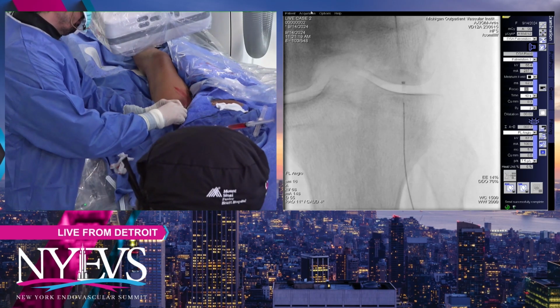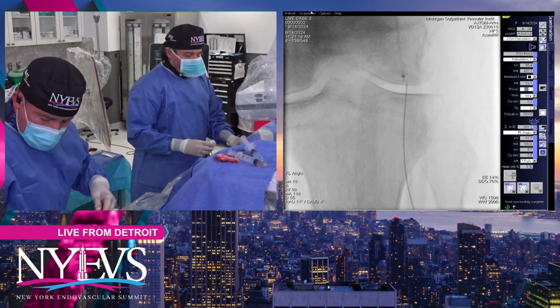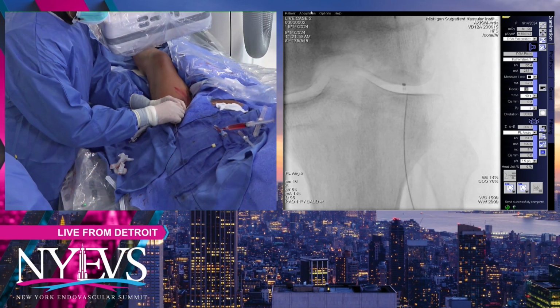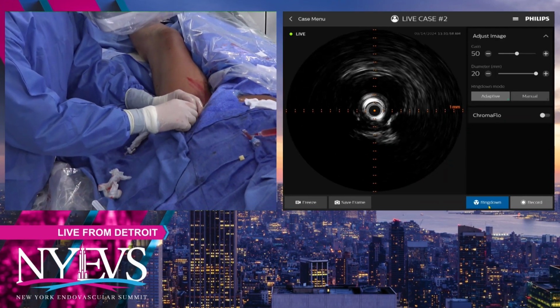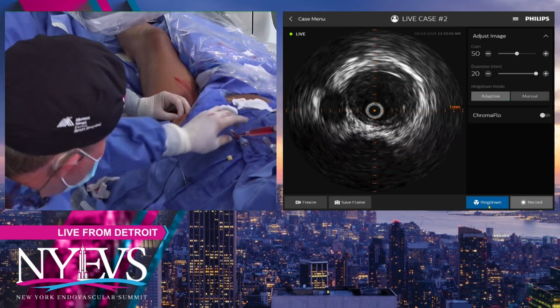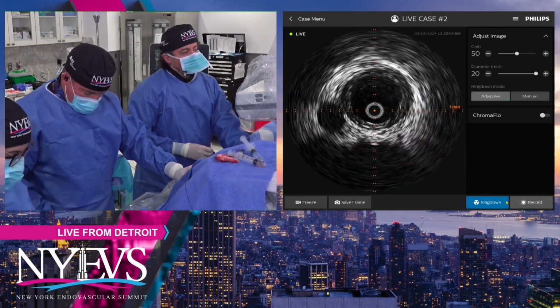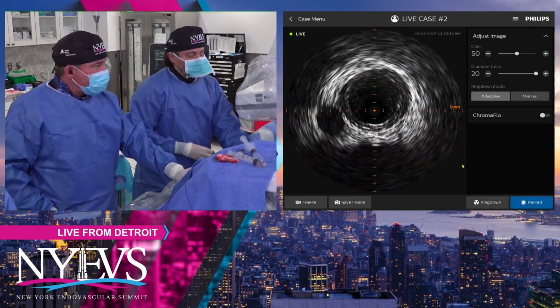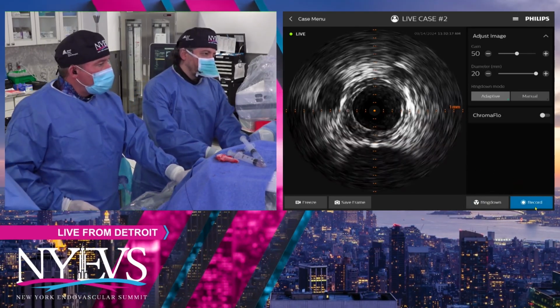Actually, we have a couple of good case series on the TAMI procedure, which is pedal-based revascularization, and at least in those case series, our outcomes have been very favorable. But a couple of points were made by the panel: making sure that you have a relatively healthy plantar circulation is important. And having ultrasound right then and there is also important because you want to make sure that when you remove your sheath, you have patent hemostasis.